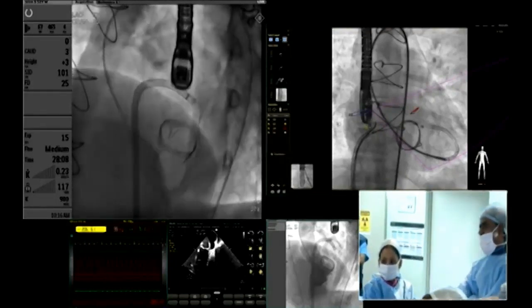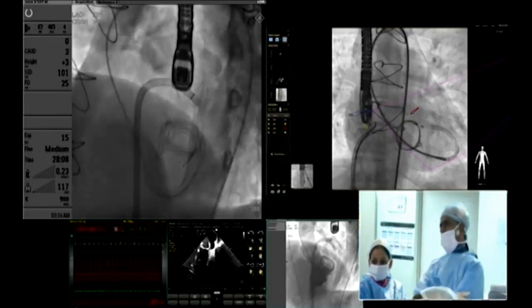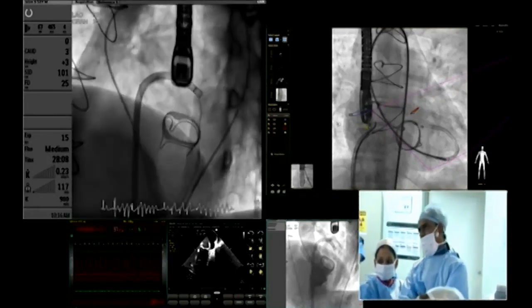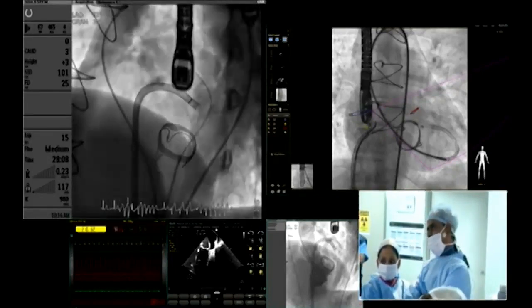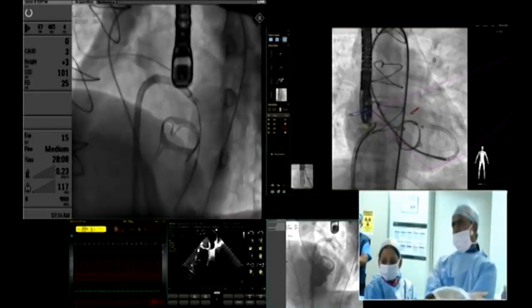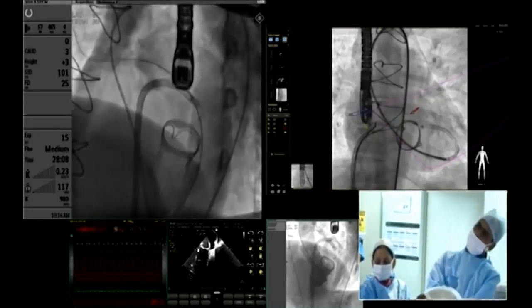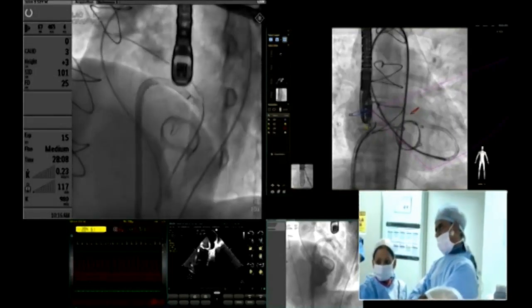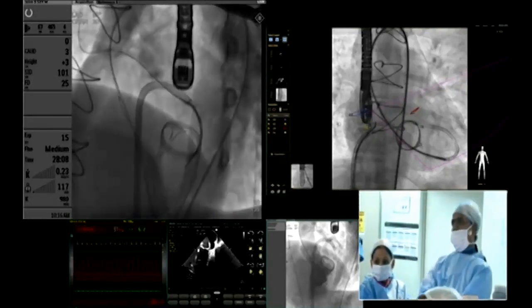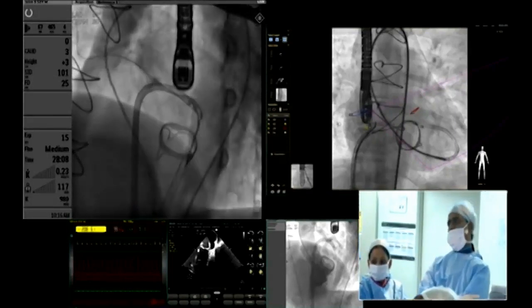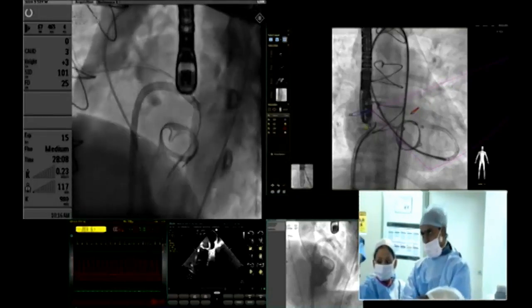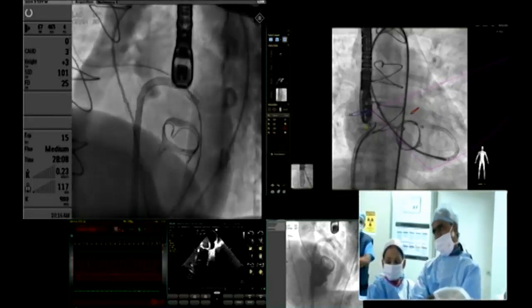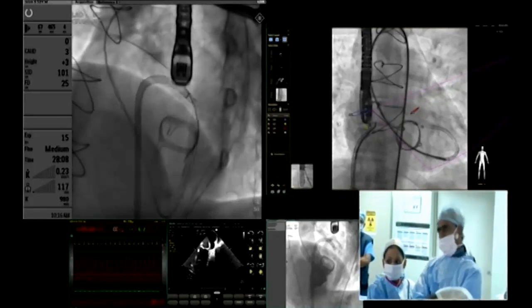After crossing, we railroaded it. If you use a Judkins catheter, take the smallest curve — if you have a 3-curve on the table it will be better. Sometimes if you don't have a small curve you can take an IMA catheter, which also helps in taking the wire from LV to LA. The second choice would be an EBU catheter guide.